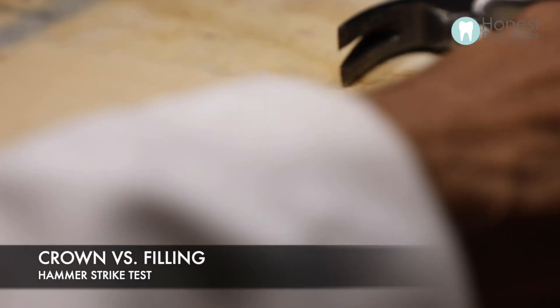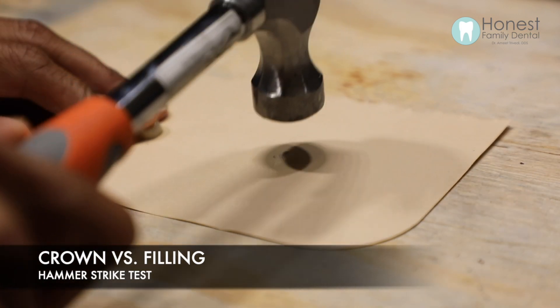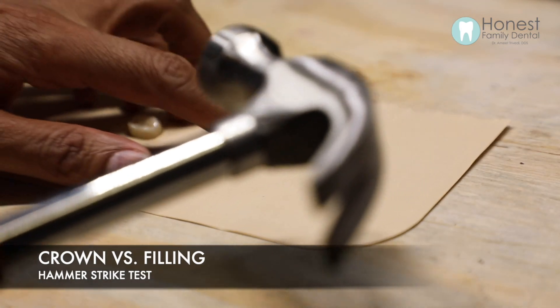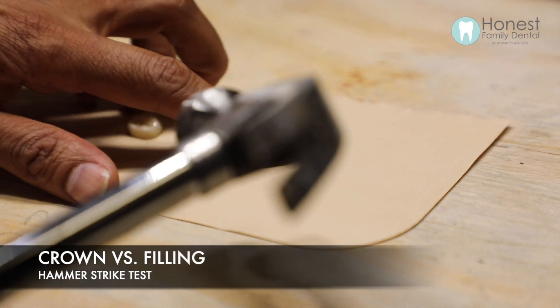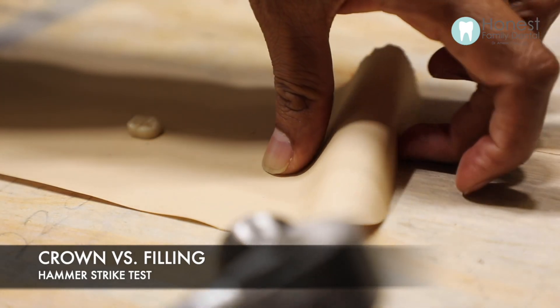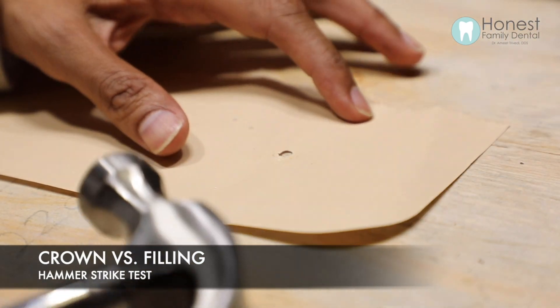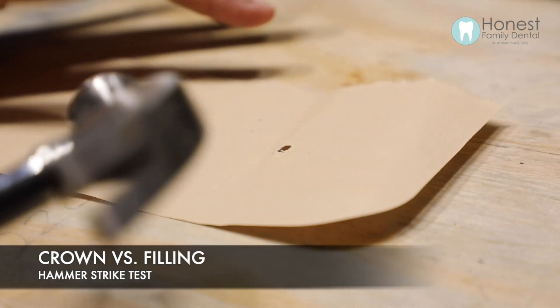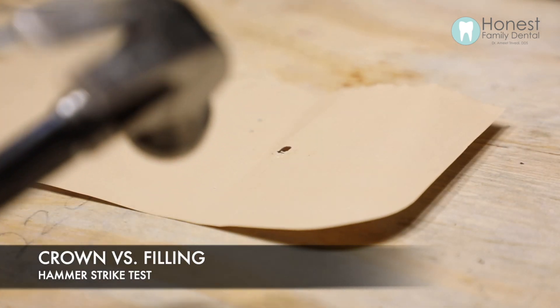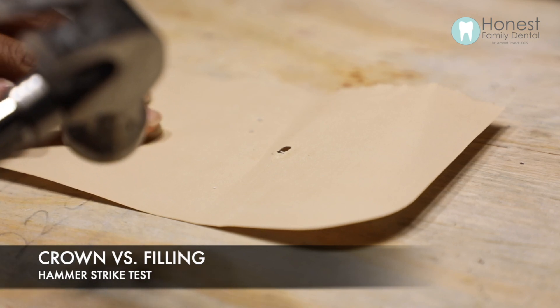Hammer time. The filling material began to crumble and parts of it shattered everywhere. It is a very strong material and it did embed into the wood, but parts of it still shattered out throughout the area. So it did withstand a bit, but it did crumble.